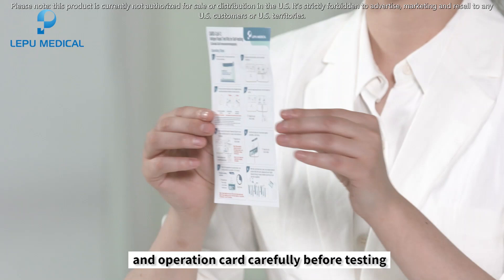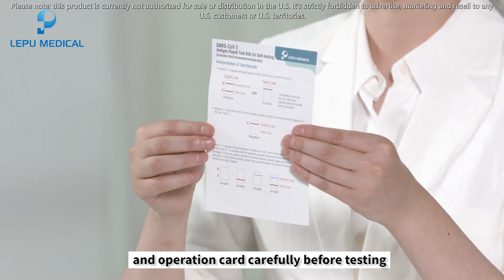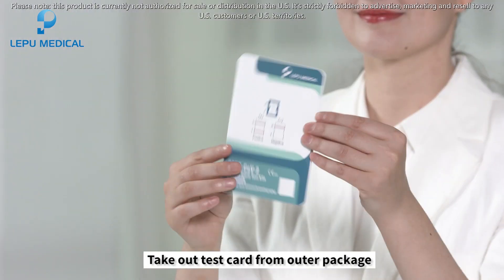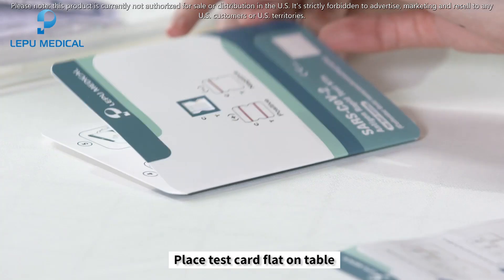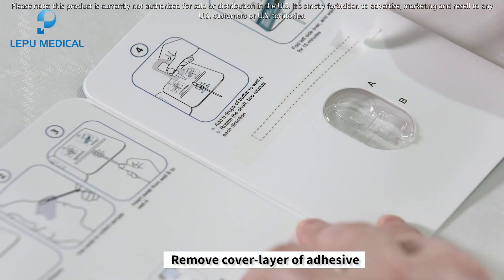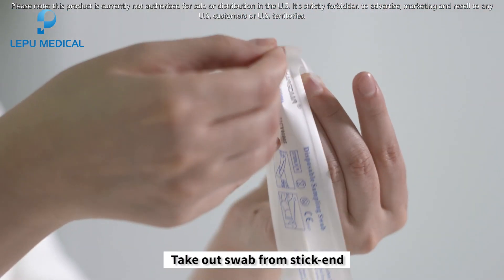Read the instructions for use and operation card carefully before testing. To operate the test, take out the test card from its outer package and place the test card flat on the table. Remove the cover layer of adhesive, then take out the swab from the stick end.